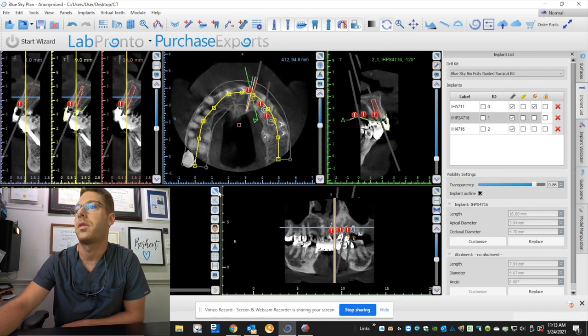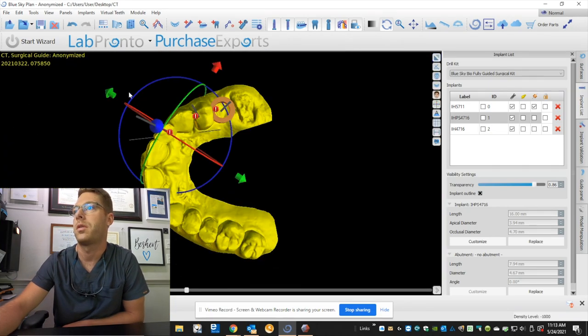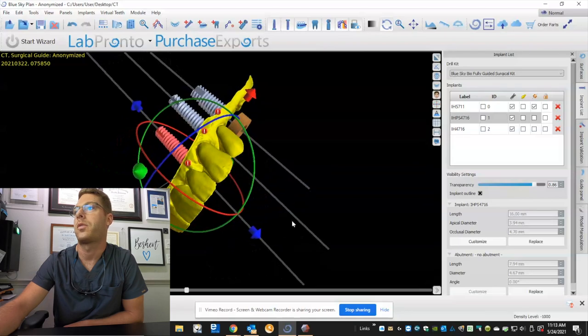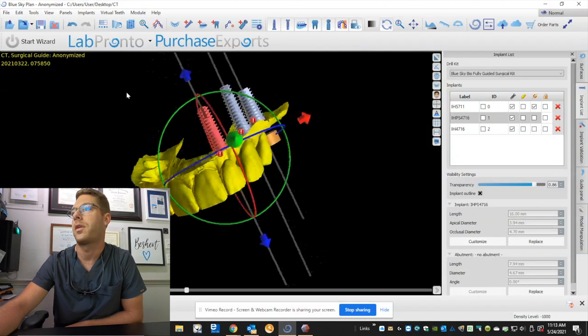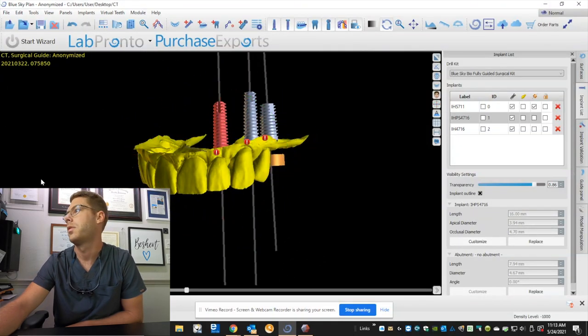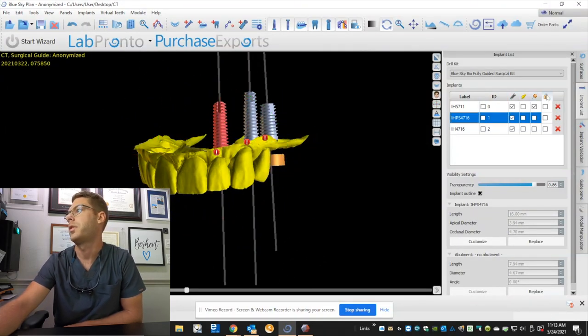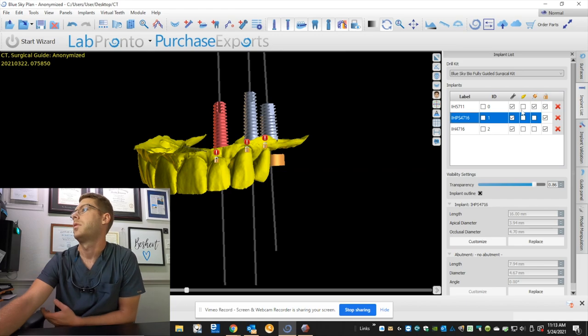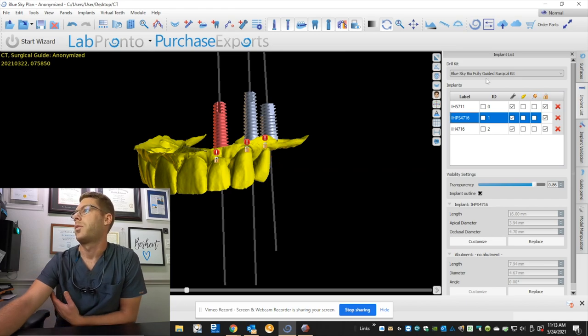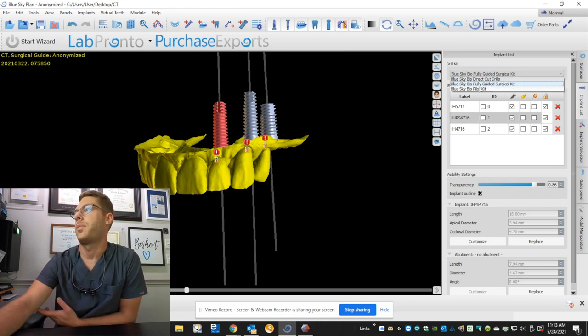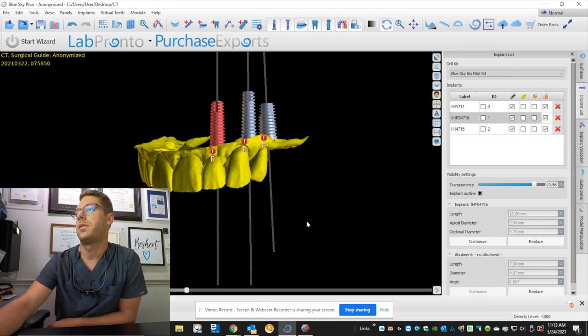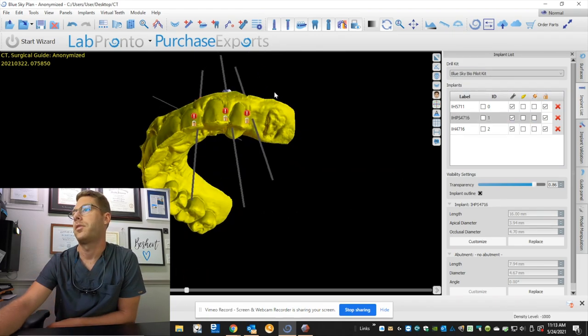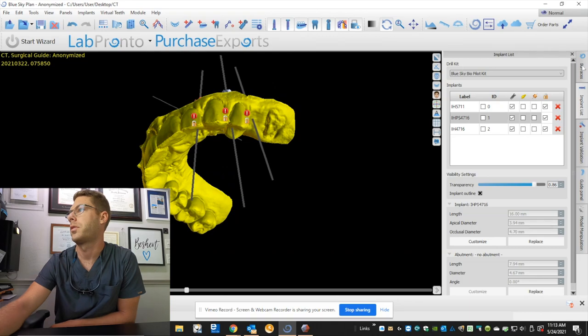Okay, so now we have our three implants that are designed exactly where I want them to go and their depth. Let's go ahead and lock these in place. And we're going to be using the Blue Sky Pilot Kit. And let's design our surgical guide.